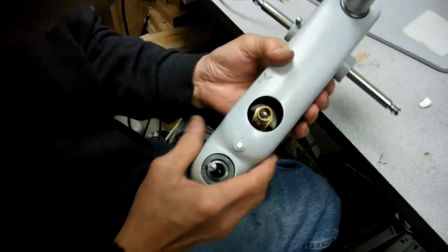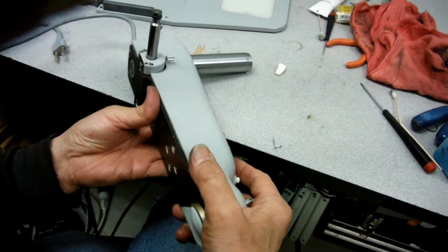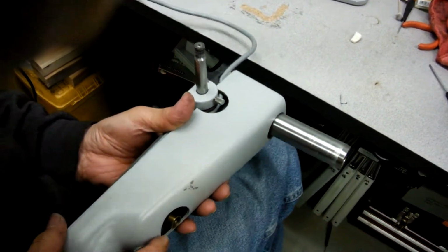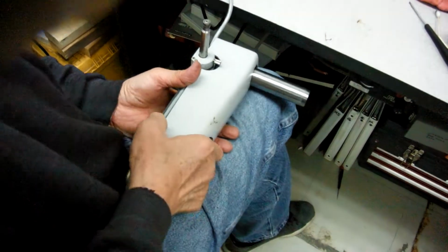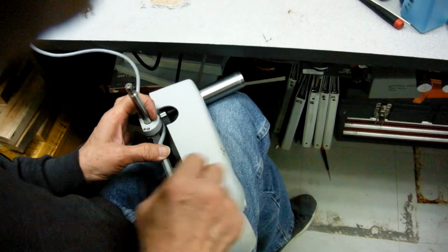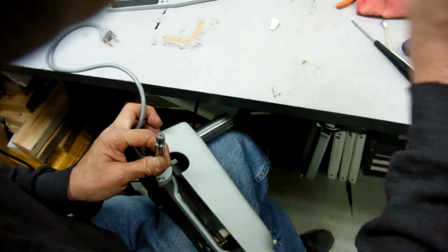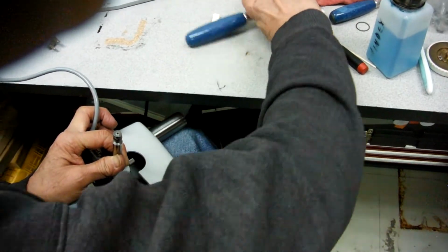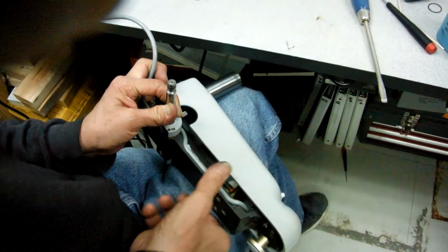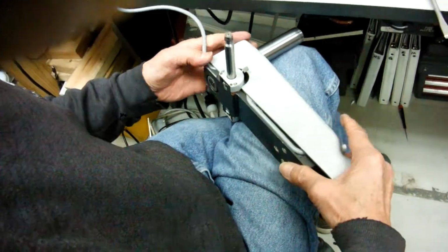A lot of times it's not easy to come in because of the wire here. So what you need to do is make sure the wire is pressed in place. This needs to be pushed all the way in. Okay, if it's not in, you can also use the wooden screwdriver and just tap it to make sure it's all the way in, and that way it's going to be easy for you to put everything back in place.